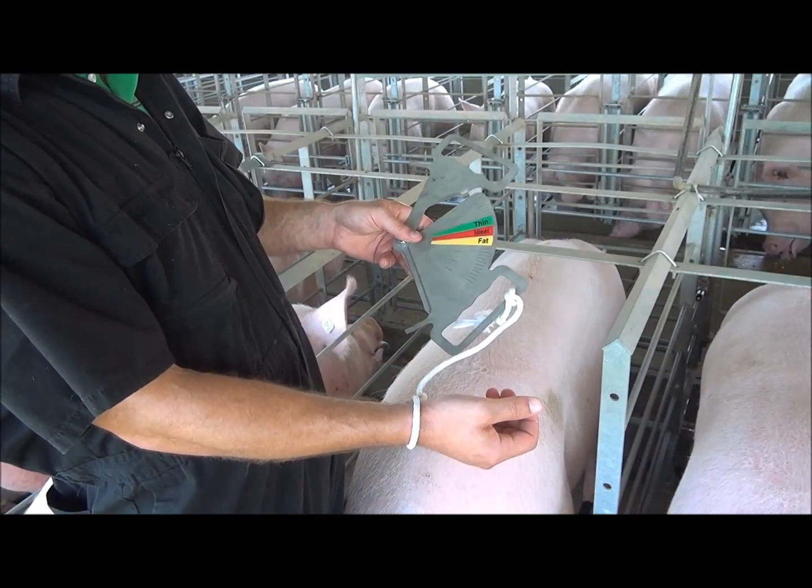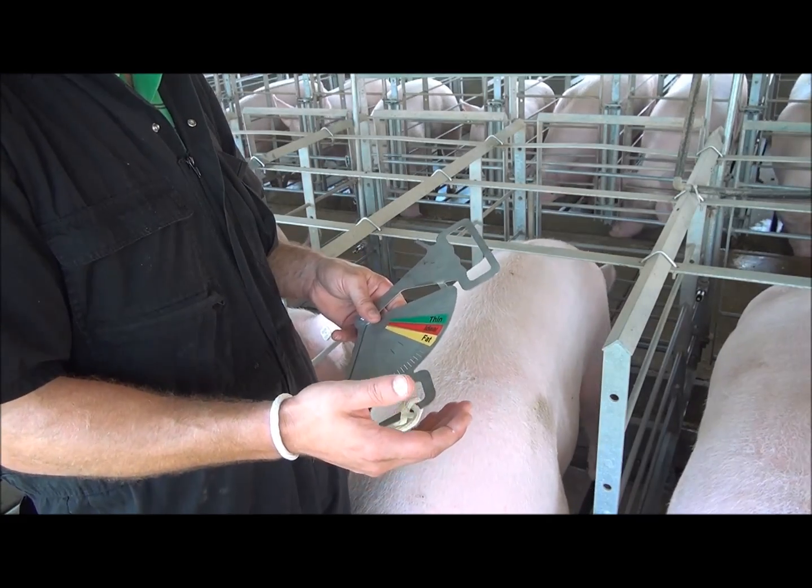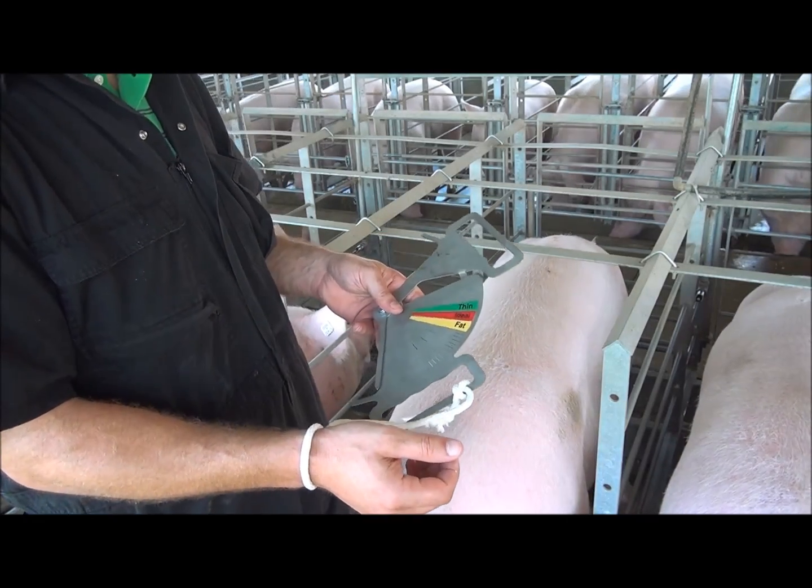As you can see here, I've tied a string to the caliper. Some people have started doing that to keep the caliper from falling into the pit.